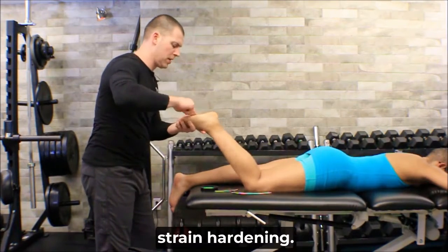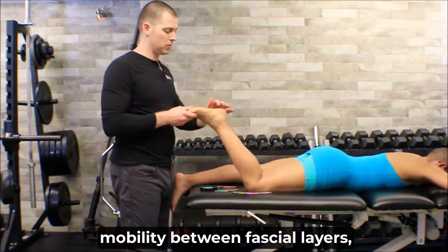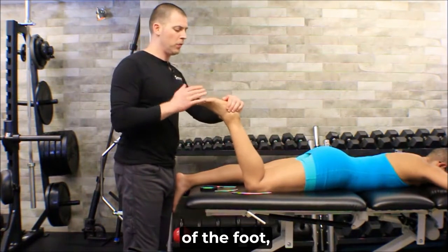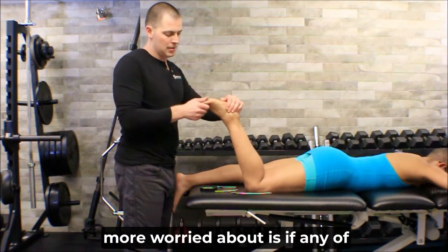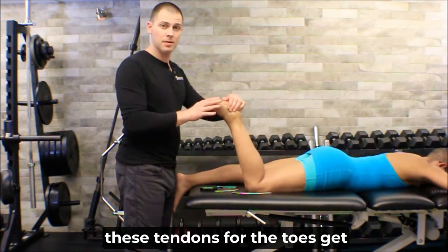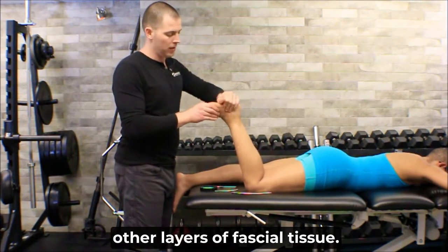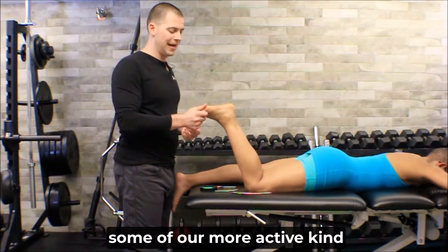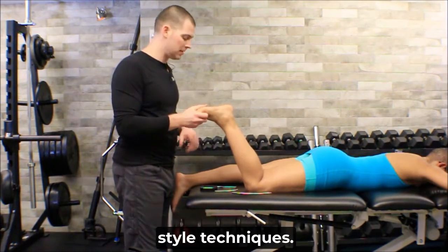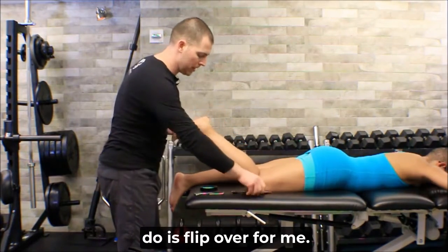Now, we talked about the strain hardening. We could also talk about mobility between fascial layers, although in the case of the foot, the restriction we're probably more worried about is if any of these tendons for the toes get bound down to their sheaths or other layers of fascial tissue. So what we might want to do is some of our more active pin and stretch style techniques. So what I'm going to have Sonia do is flip over for me.